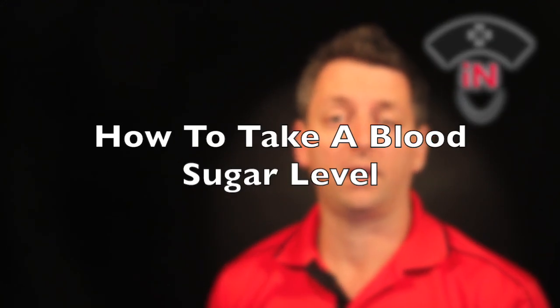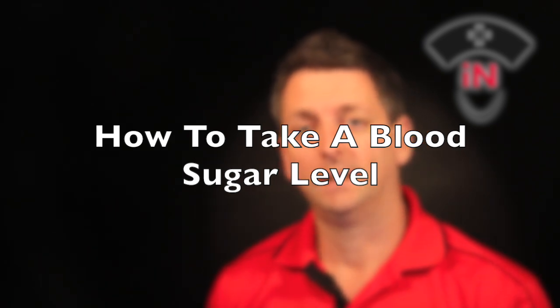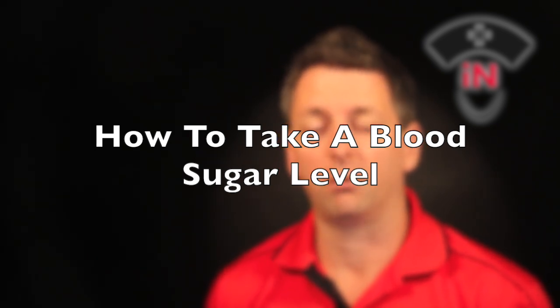Hi, I'm Phil and today's episode of Nurse On The Go is a bit of a sweet tooth special. We're going to look at how to take a blood sugar and the most accurate way to do it.